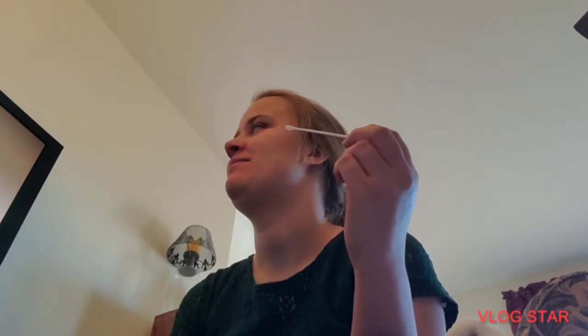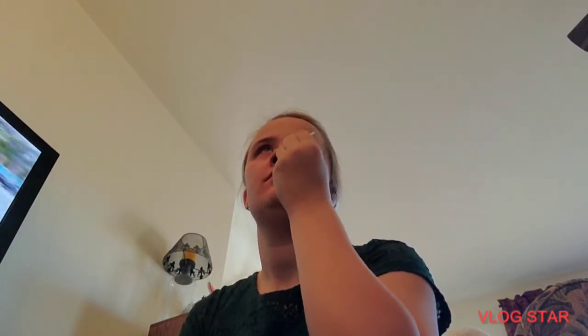Just hold it. Swab both nostrils. Stick it in just as high as it's comfortable. Swab five times in a circle. Five times. No, you've got to move the thing around five times.